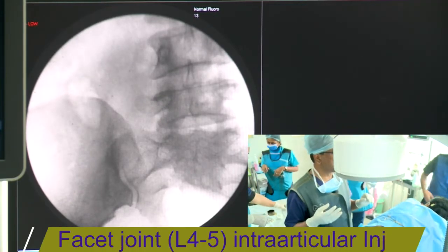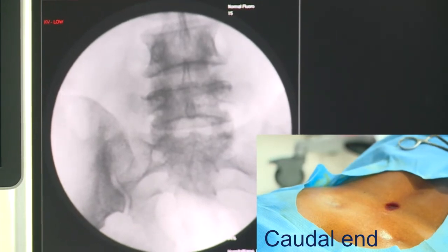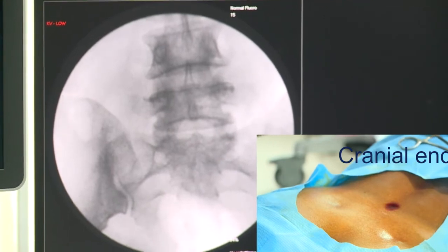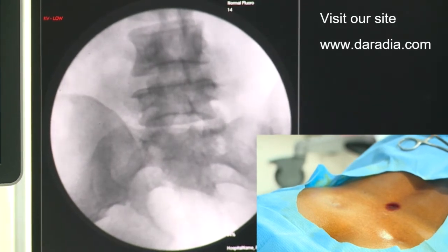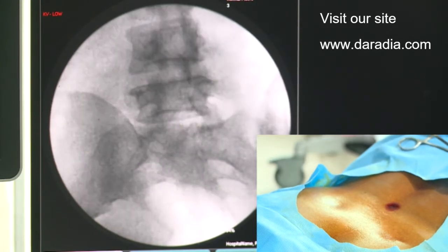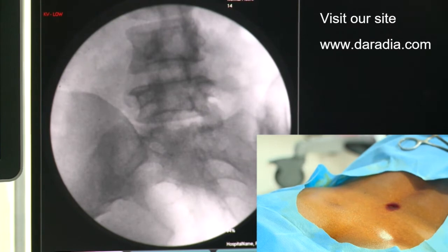First is true AP, next is endplate parallel, next is ipsilateral oblique and the facet joint will be opening up and you will be able to see the Scottish dog image. So now you can see the Scottish dog image. The facet joint is gradually opening up at the level of L4-5.